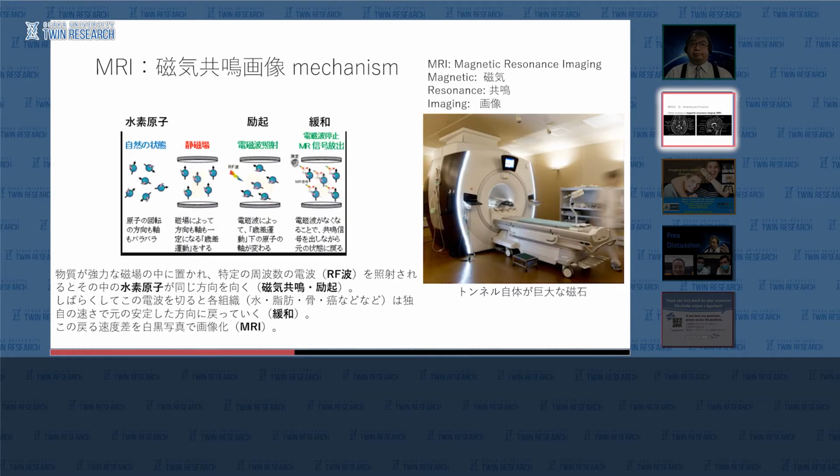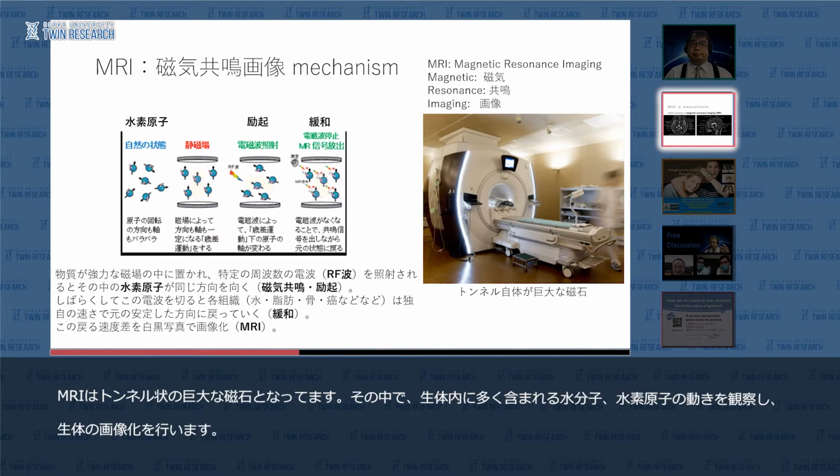The MRI scanner is essentially a giant magnet. The strength of the magnet is measured in a unit called Tesla. Most MRI scanners used at hospitals and medical research clinics are 1.5 or 3 Tesla.